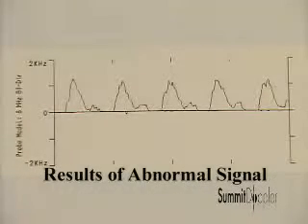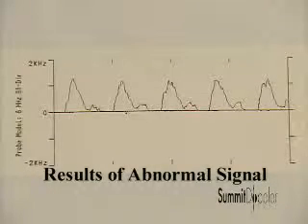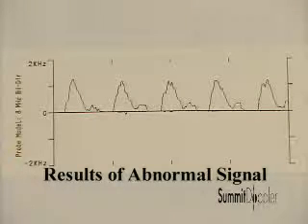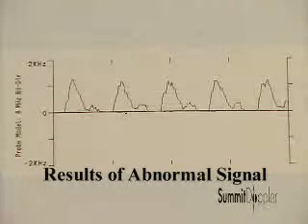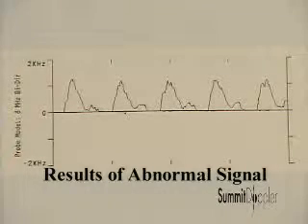Here is another set of abnormal posterior tibial waveforms. The key characteristic here is the slow decay. Also, note that the reverse flow component is absent. These waveforms are associated with mild to moderate disease.